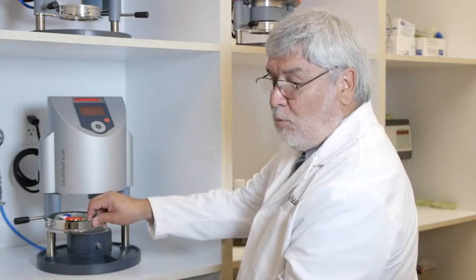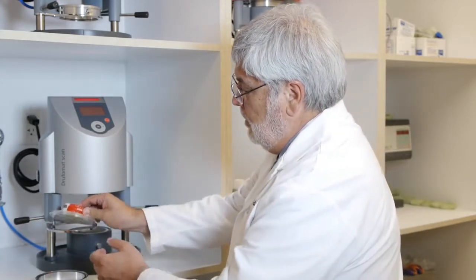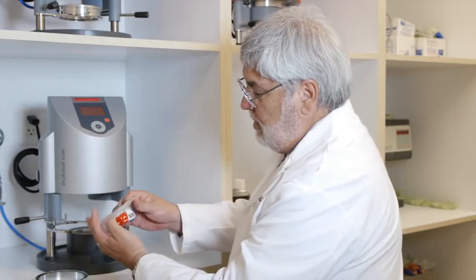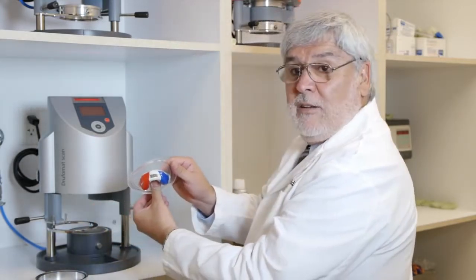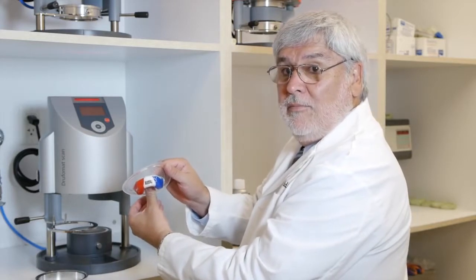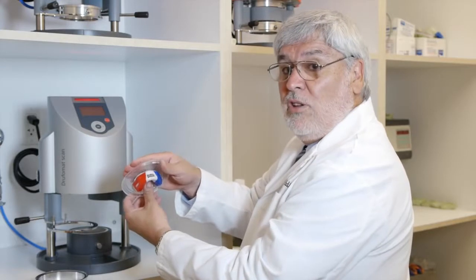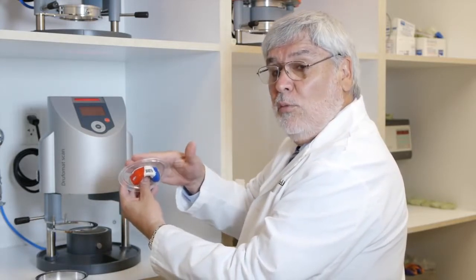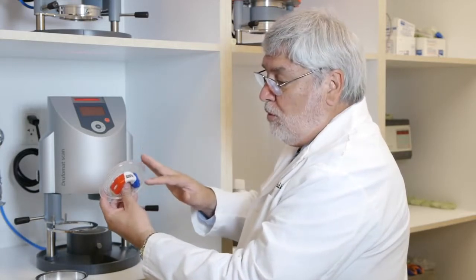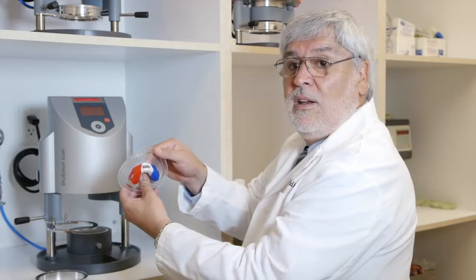Now I remove the top ring, remove the finished appliance, and there's my TechFit red, white, and blue mouthguard. Now this has to cool sufficiently. It's still a little warm, just like the first layer. We want this to cool to room temperature. Once it cools to room temperature, then we can cut it, trim it, polish it, and we're ready for the patient.